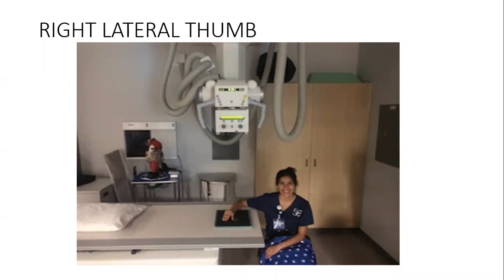My name is Christopher Eric Granger-Bell, and this is my Chapter 4 presentation of the right lateral thumb. I greeted the patient upon arrival and verified her full name and date of birth.